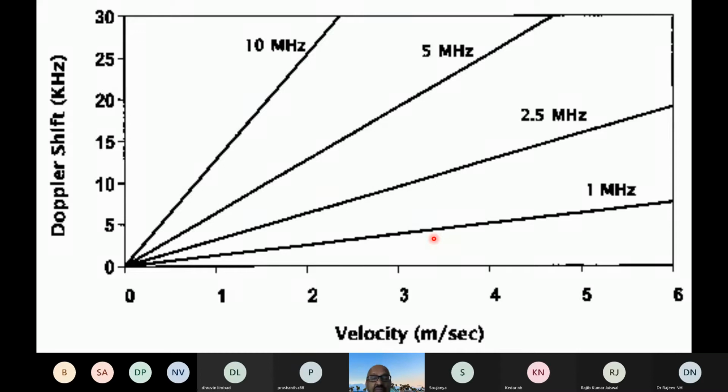I will again repeat. In Doppler, for us to get the exact value of velocity, that is the speed and the direction of blood flow, the beam has to be parallel to the flow of blood, whereas in two-dimensional echocardiography, it is perpendicular. When you want to get the best quality image, it should be perpendicular. So this is the first paradox.